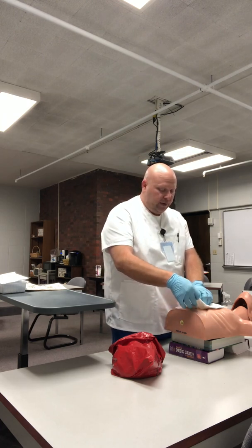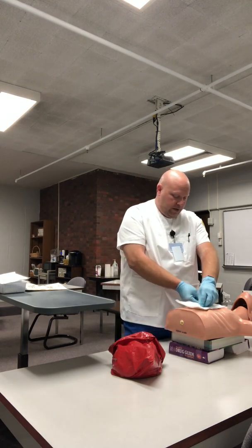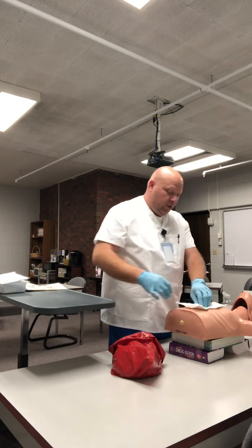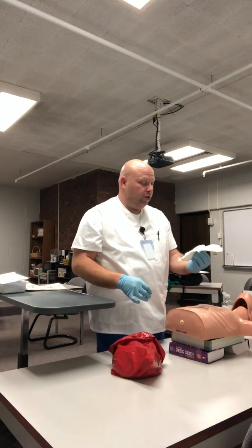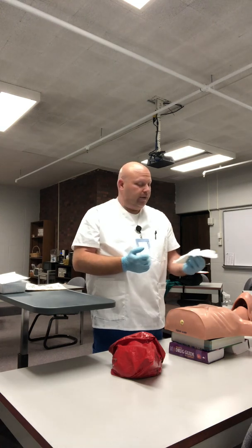I'm going to take the tape and pull it up starting in one corner, working all the way around. Coming around the other side, I'm going to pinch it in the middle and pull it straight up. I'm going to assess this bandage. I'm looking at the color of it, the amount of drainage in it, and the odor of it.